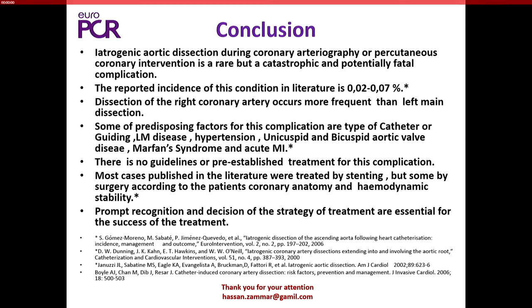In our hospital, we had probably the same case, but we lost the wire and we couldn't cannulate again. So I think it really depends on where the dissection is coming from. In these cases you were lucky, because the lumen was open and the origin of the left main was open. But we had a situation where the dissection came from the mid shaft of the left main.